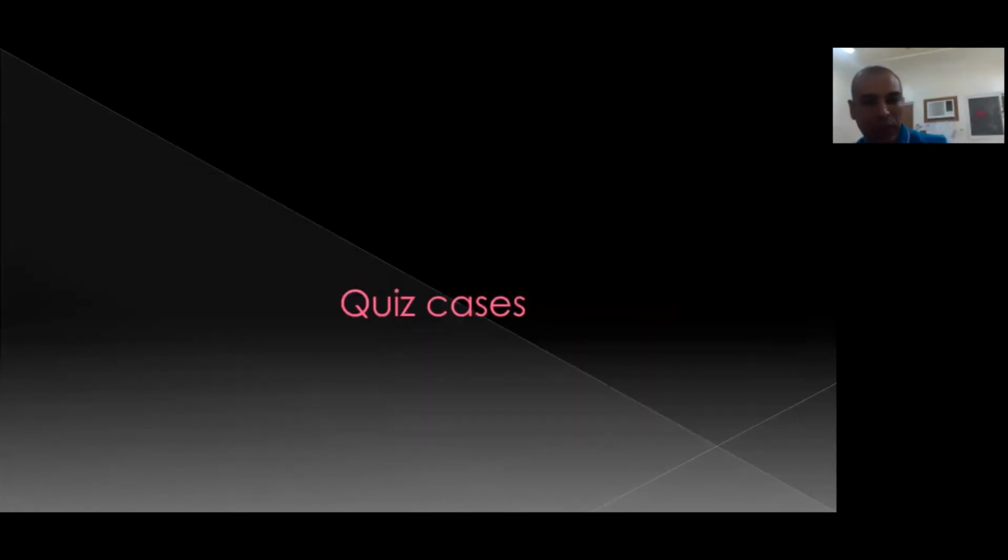We have around 15 minutes, something like this, for the quiz cases. I think we have 9 or 10 quiz cases. If we have any volunteer to participate in this quiz, it's very simple and very easy, to finish our lecture and to revise our checklist point by point. If anyone wants to share, just raise his hand, and I think Rimas can help us in this issue.